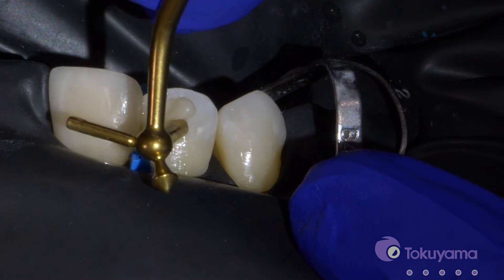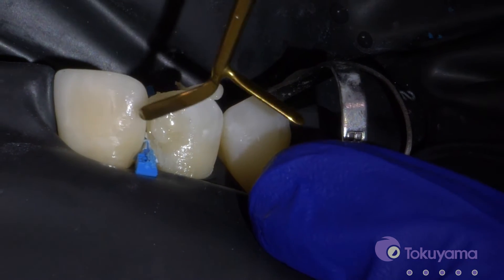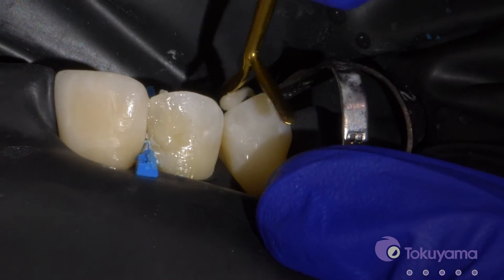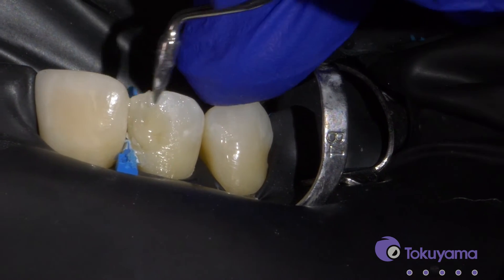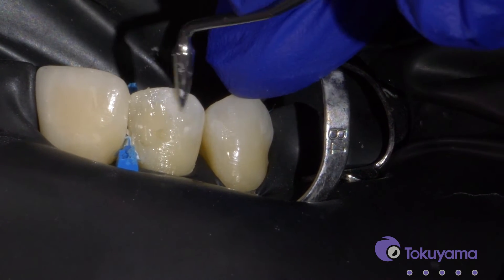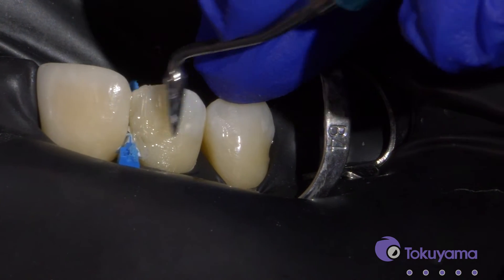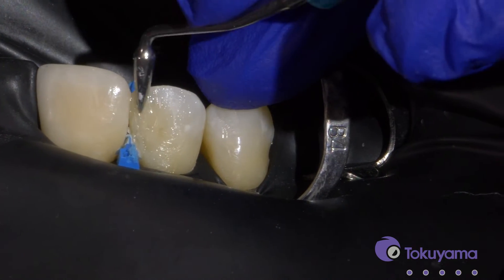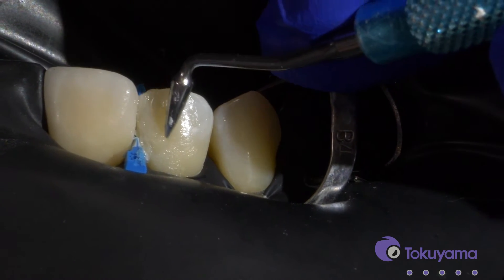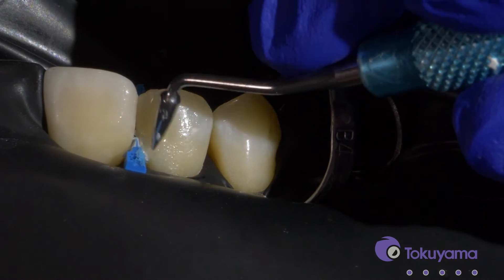I put a little bit of flowable and then I'll just put some more of that blocker. Then I'm still going to put a final layer of the regular Omni-Chroma for the enamel. This is actually a waxing tool that I like to use for this, just to get a little bit of the dentin shape to the blocker. We'll get it a little bit over the bevel just to not have a fracture line there.